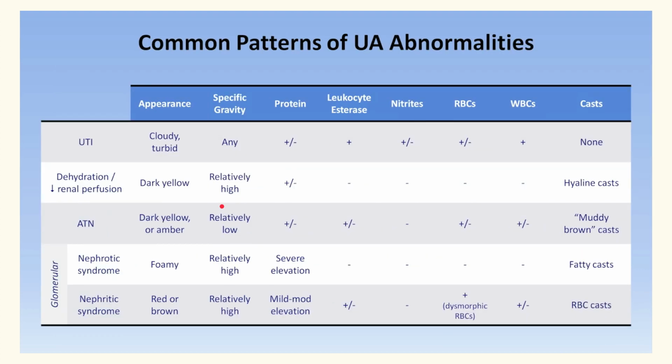Again, this is a table outlining the most common urinary tract pathologies and their respective changes in the urine analysis. You can pause the video and take a look at it if you want.